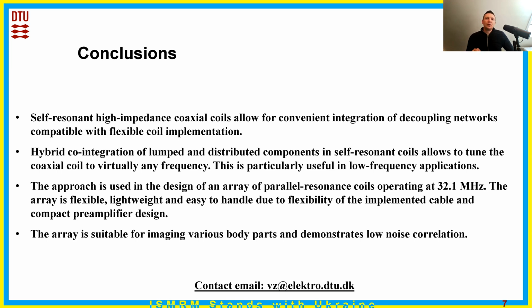The approach is used in the design of an array of parallel resonance coils operating at 32 MHz. The array is flexible, lightweight, and easy to handle due to flexibility of the implemented cable and compact preamplifier design. It is suitable for imaging various body parts and demonstrates low noise correlation.